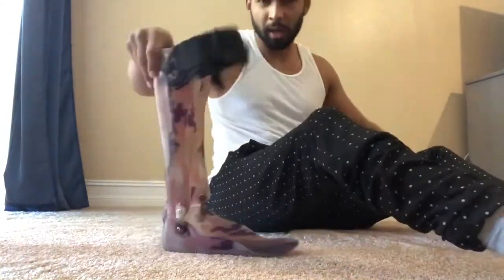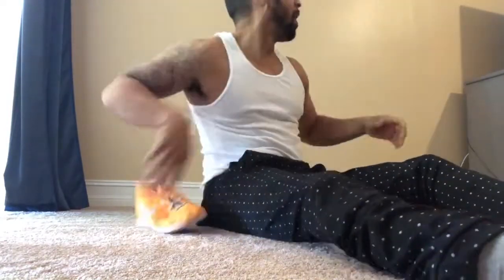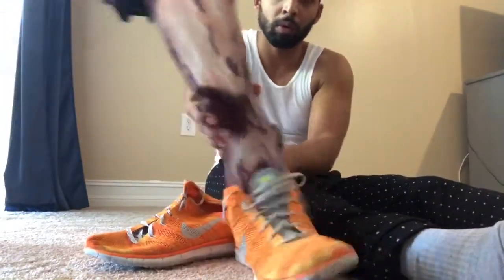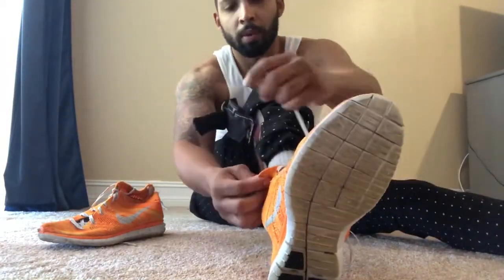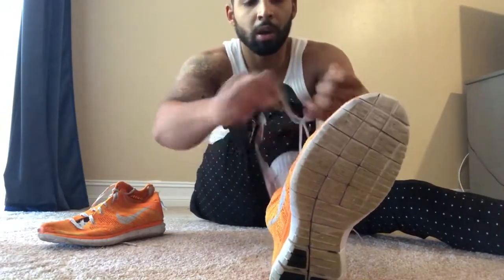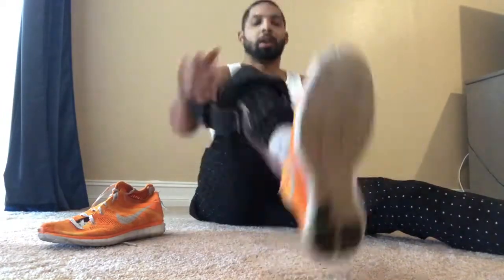AFO, right leg — put it in the shoe first. We've got two Nike shoes. They fit perfectly in here. Finally found some shoes that the brace fits perfect. Put it in the shoe. It's in. I'm going to put the tie strap on now — it's going to make it feel nice and tight and give me the extra support I need.